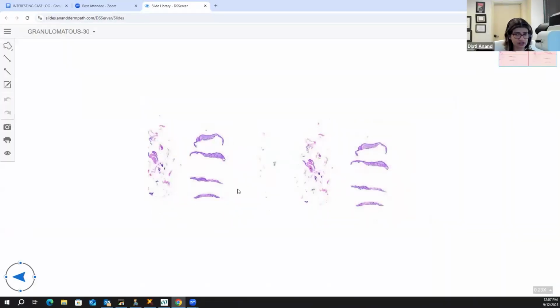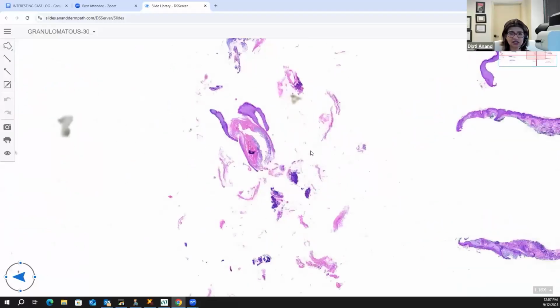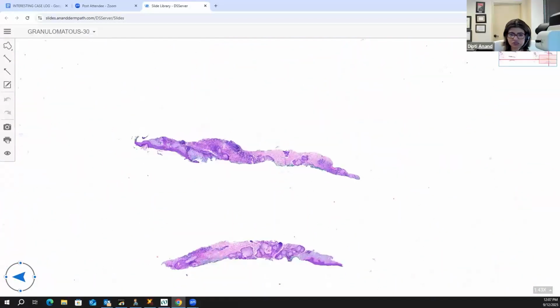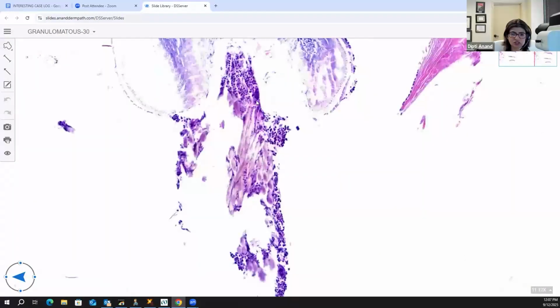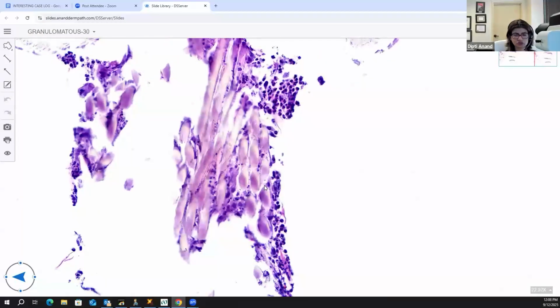And then the last one also really doesn't belong in here. This is a classic example of a spitting suture. It's again something we will talk about in the foreign body section. Random pieces of skin, and then you have to be careful in looking at what is being extruded out. And this is the suture material here. So this is a spitting suture.